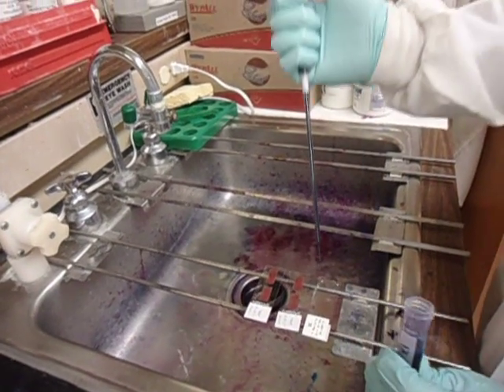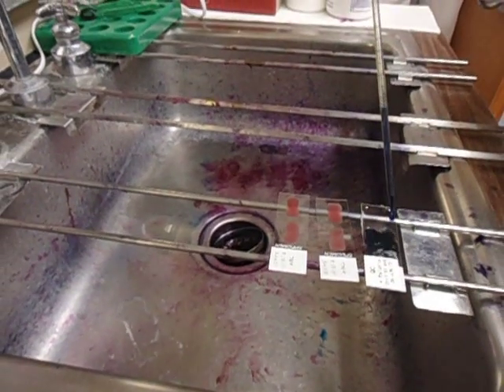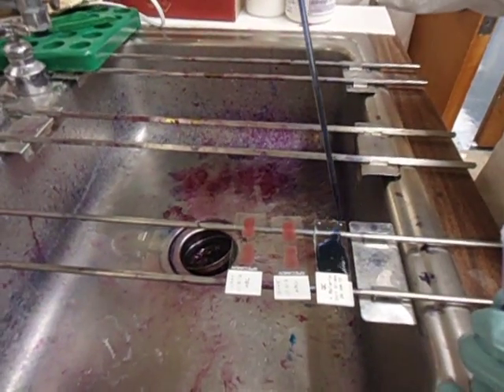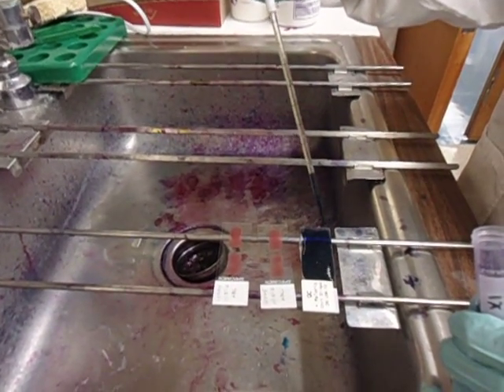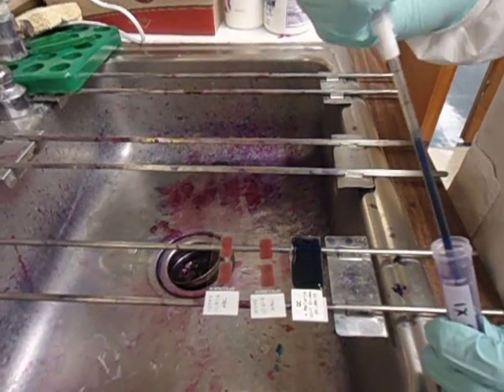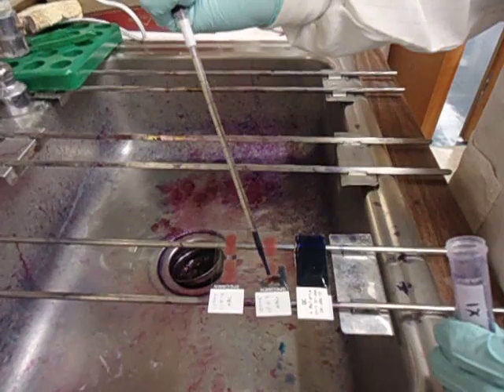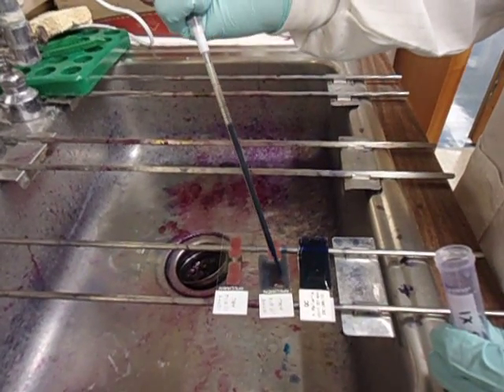I'm just going to take this and carefully drip it on top of the slide. You want to make sure that you cover the entire slide very well. I'm going to start by dripping on top of the dried blood.